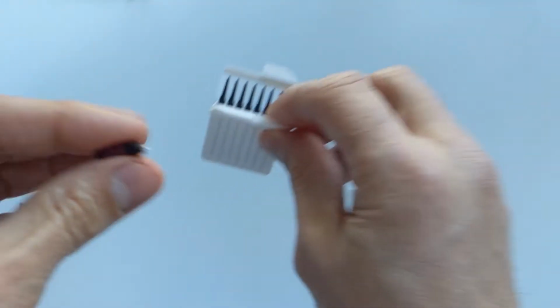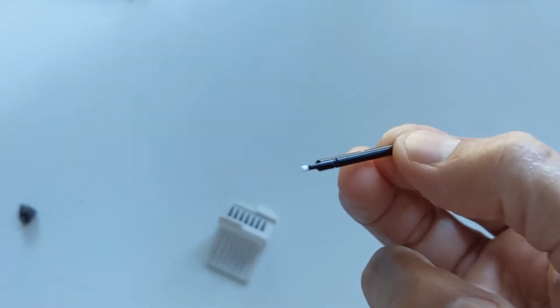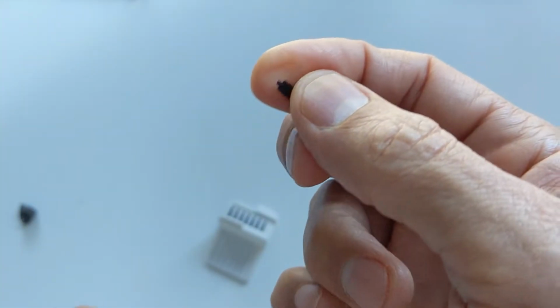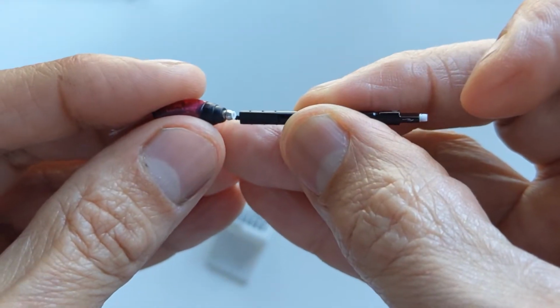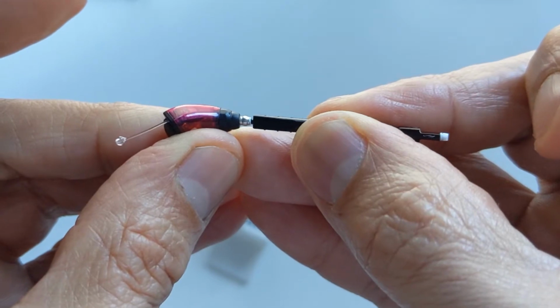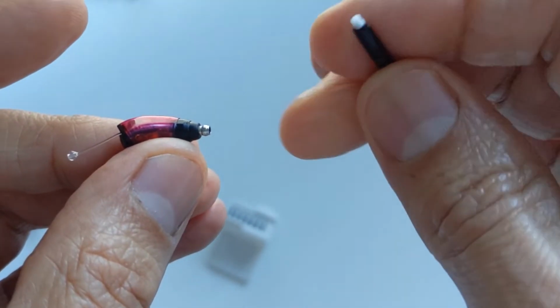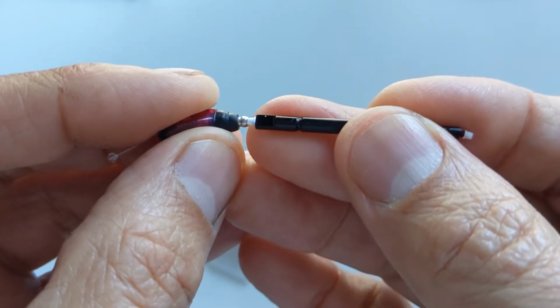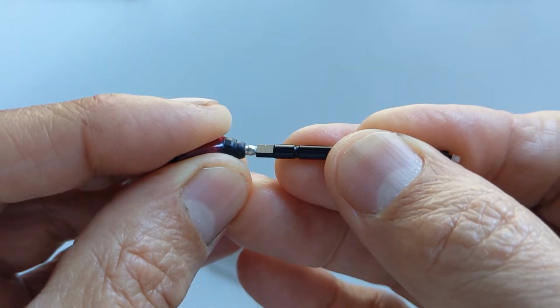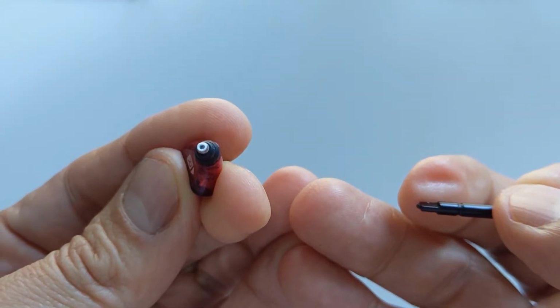I'm going to get hold of my new wax filter, which you can see there. We're going to turn it round and use the other end to take the old one out by pushing it in like so, and pull, and out it comes very easily. And we're going to turn it around and push the new one in like so, and it's that simple.